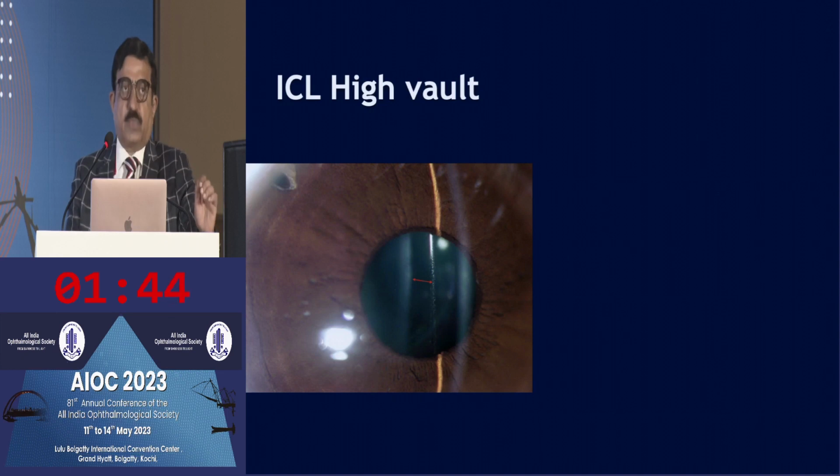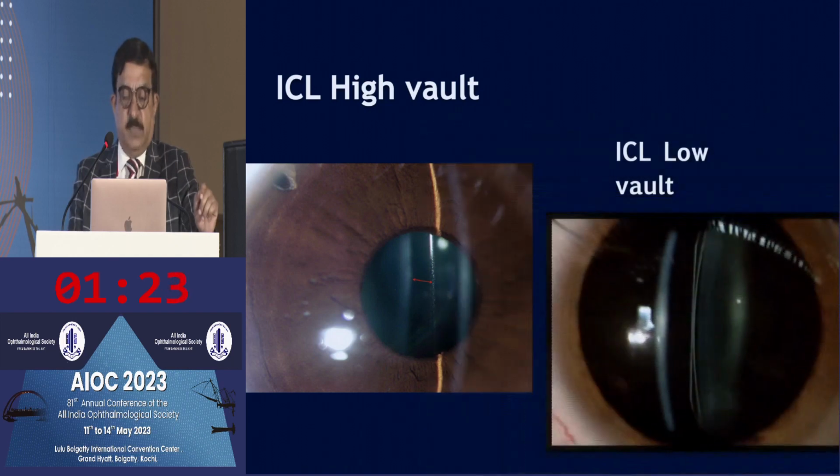and these have to be washed. But if it goes from 750 to 800, 850, and the intraocular pressure is well maintained, and of course with these current ICL with the central flow, there's not a PI. We don't have to rush in to do a PI. We just have to keep a watch on the intraocular pressure, and gonio can be done intermittently.